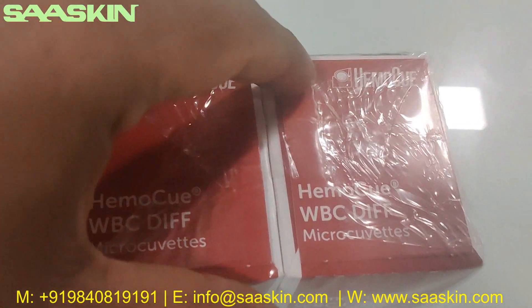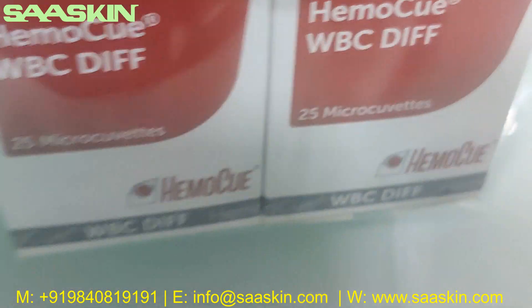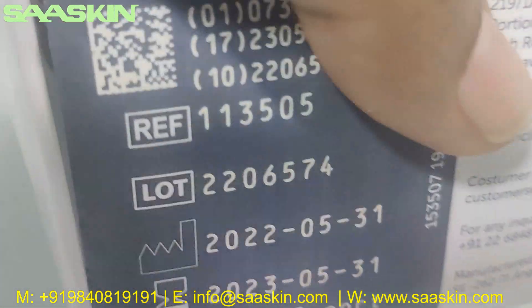Let me just show you around. You can see this. We get a pack of two boxes in a single pack. You can see this here.